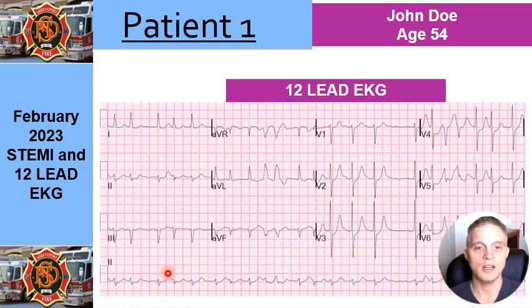That's an abnormality, but it's not sustained. So T wave morphology in this 12 lead looks generally uncompromised. And then you look at the ST segments. With ST segments, you always want to make sure that you find the isoelectric line, which is the line in which you have your P wave, and then where you're going back up to your T wave, and they meet in that middle. If you have any type of deviation from that, that's a depression or an elevation.